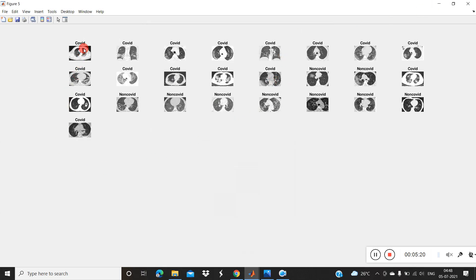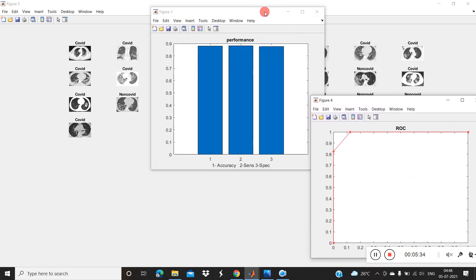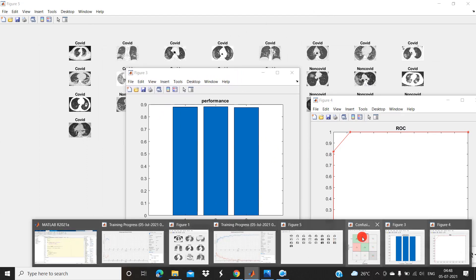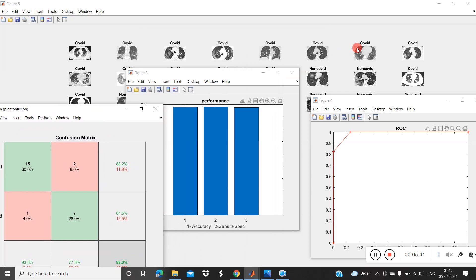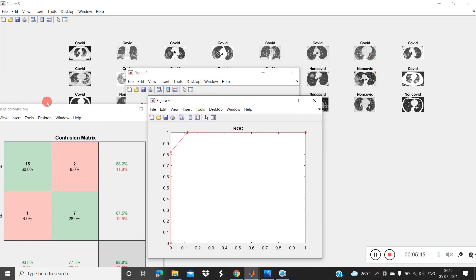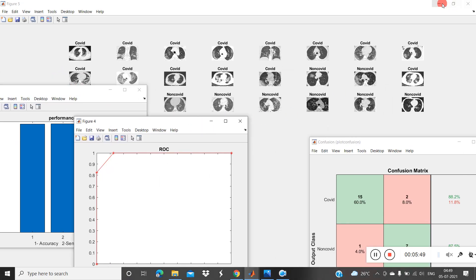These are some test images. This is a COVID sample — COVID, COVID, COVID, COVID, COVID. And these are the non-COVID images. The system has classified them correctly as COVID or non-COVID. Finally, we are getting the performance of the system along with the confusion matrix.